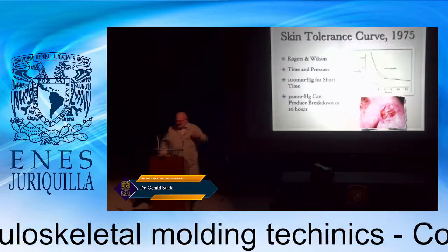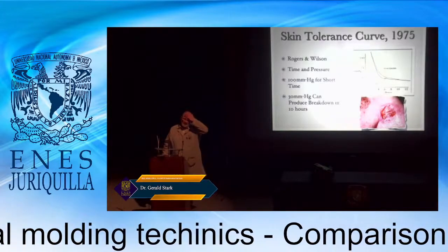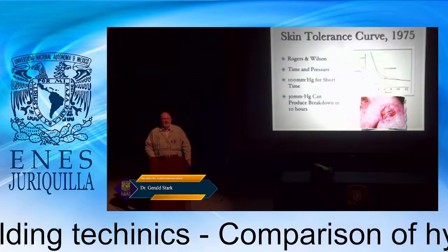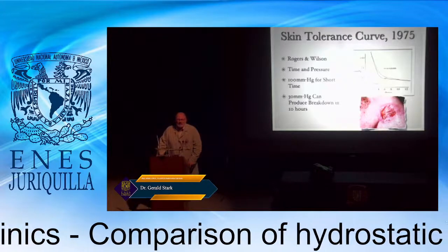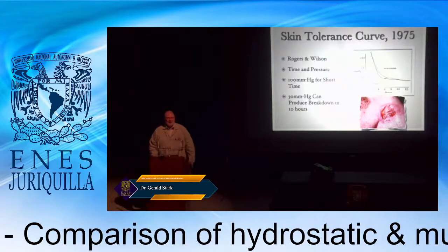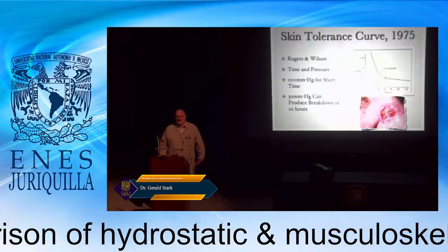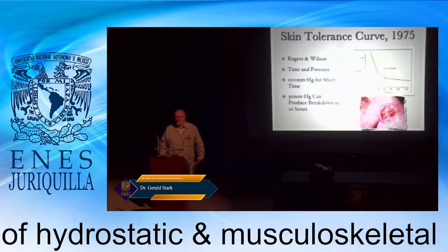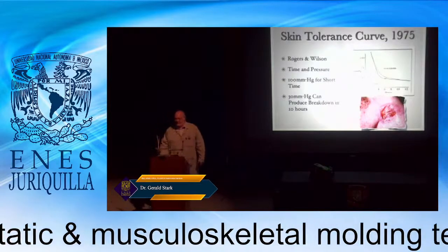Now he did something, he checked how happy people were. And I think it was around 1998, he found that 63% of all patients were still unhappy with their prosthesis at that time, even with better materials. The thing is that the limb can be loaded. It can be loaded with a greater amount of load, but over a shorter amount of time.